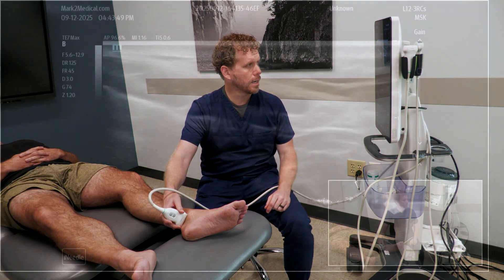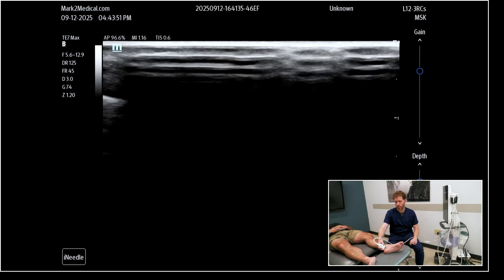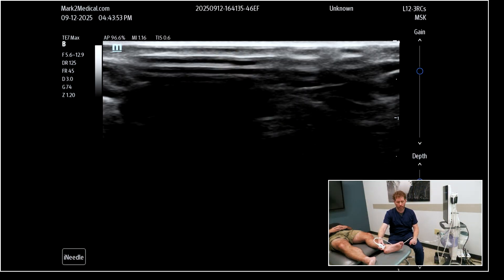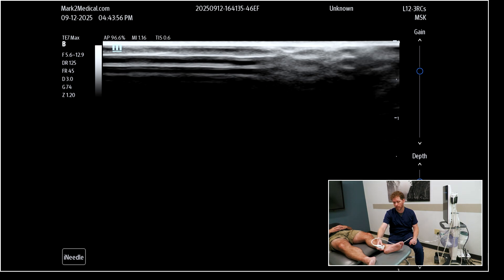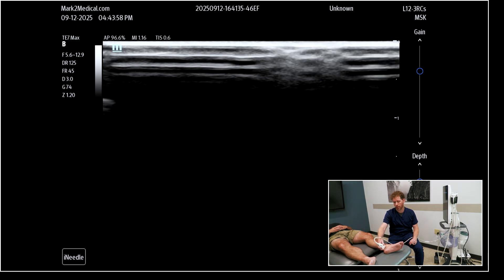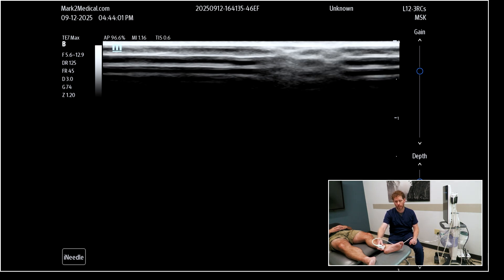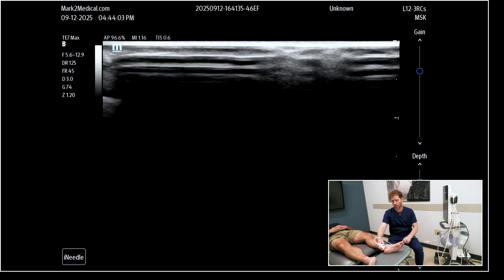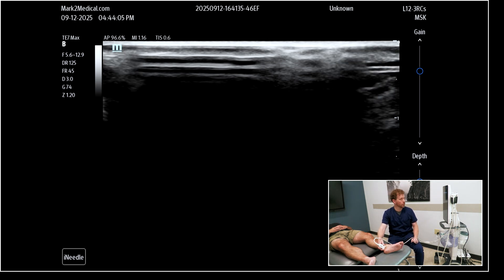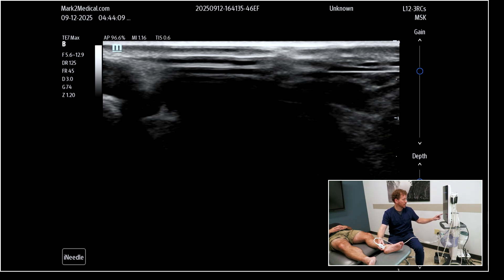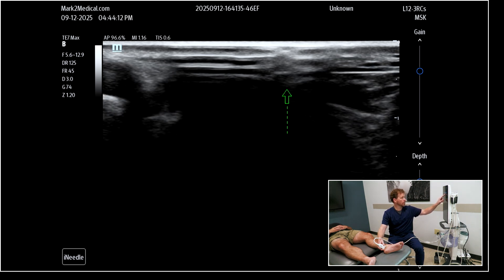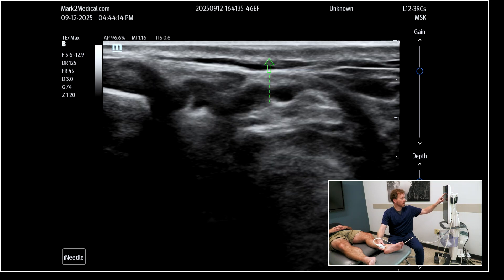When I put the ultrasound on, this is sometimes a difficult spot to scan because you can get an air gap in between the Achilles and the medial malleolus — you're getting good contact with the probe on the Achilles and the medial malleolus, but you just don't have good skin contact in between. On our ultrasound image you can really see there's basically dead space with no information right here because we're not getting good contact.